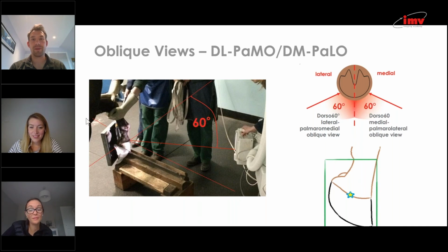Yeah, no, I think that makes sense. It's really helpful having the diagram to be able to see it and just to help visualize it as well. Great. And so we had another question coming after that, which was just giving advice about exposure settings to view the dorsal hoof wall. So I don't know if we have any thoughts on exposure settings for looking at that part of the hoof anatomy.